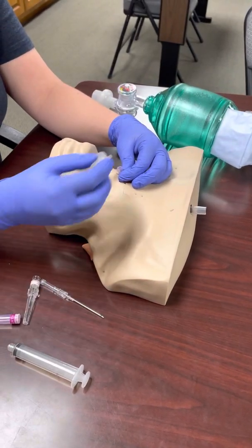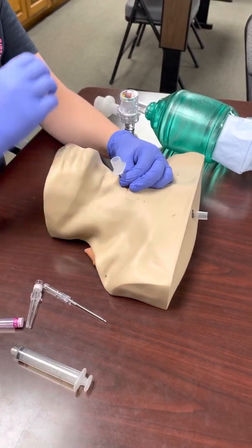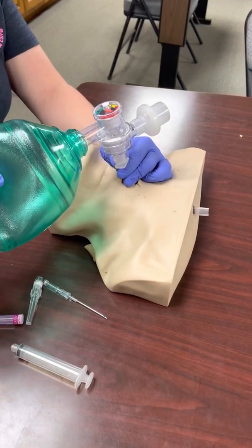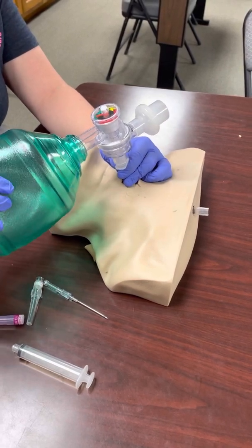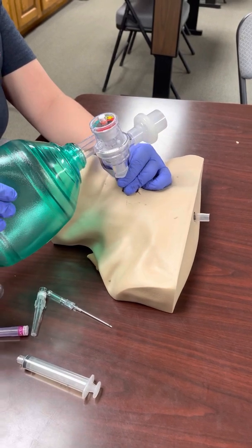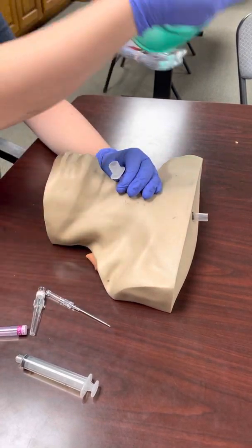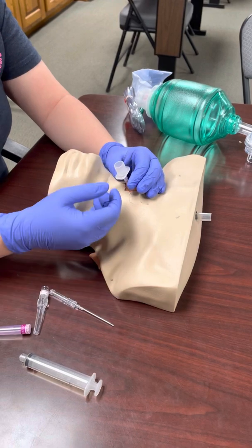Take your size 3 ET tube adapter, put it right into the plastic catheter, and now you can hook up your BVM. As you can see, you're pushing air through a very tiny catheter compared to some of our cric kits, so you're not delivering a huge tidal volume. That's why it's more preferable for kids, especially infants — but it is better than nothing, so it's still a nice backup technique.